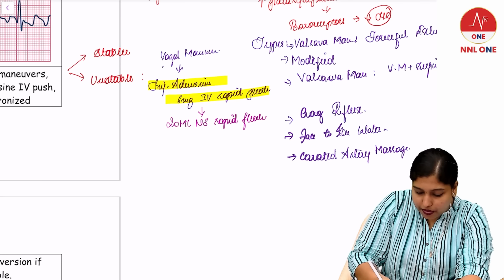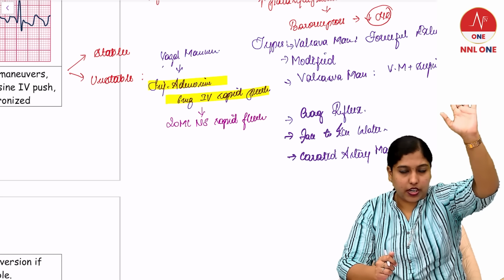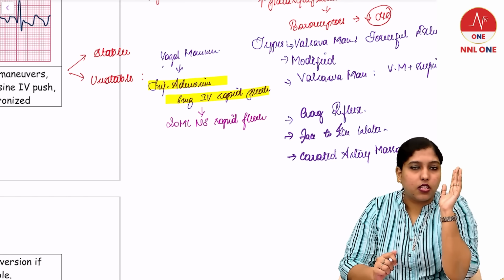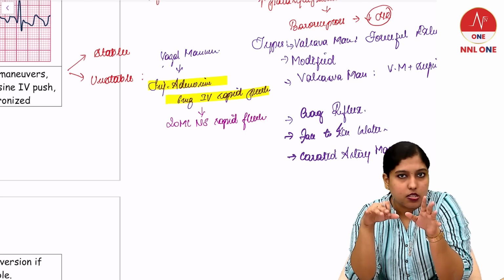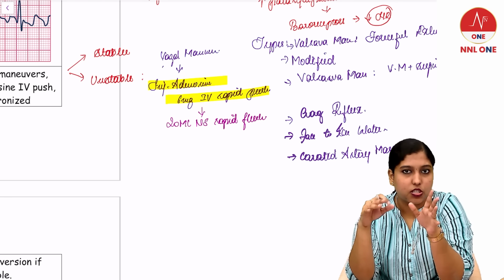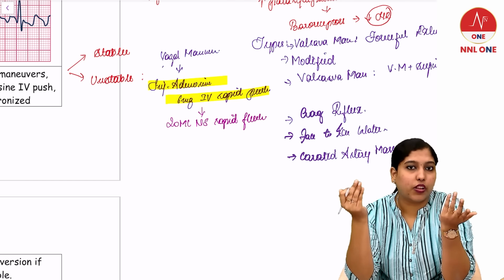Once this rapid flush is given, what did my TL do? She lifted his hand above the head, and what happened? There is a sudden asystole and a rhythmic change. The patient recovered from SVT. So this is what has happened after administration of the adenosine.